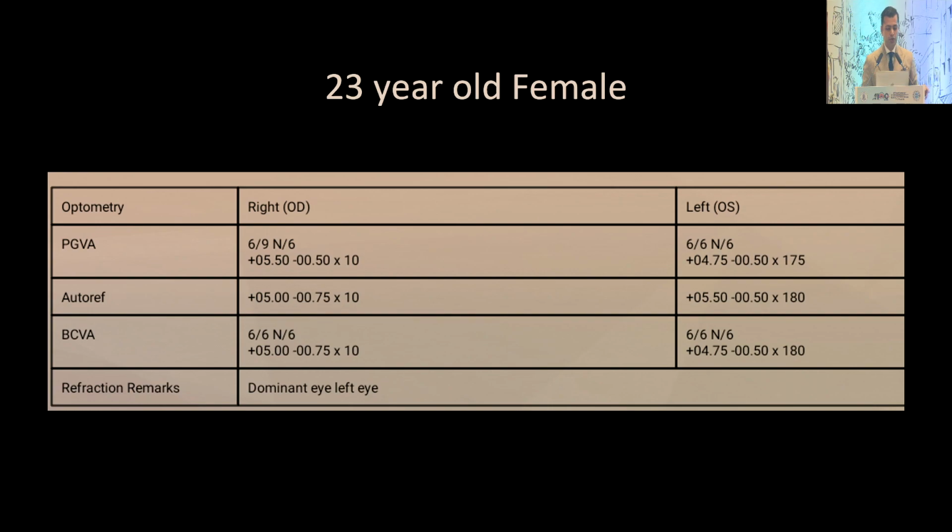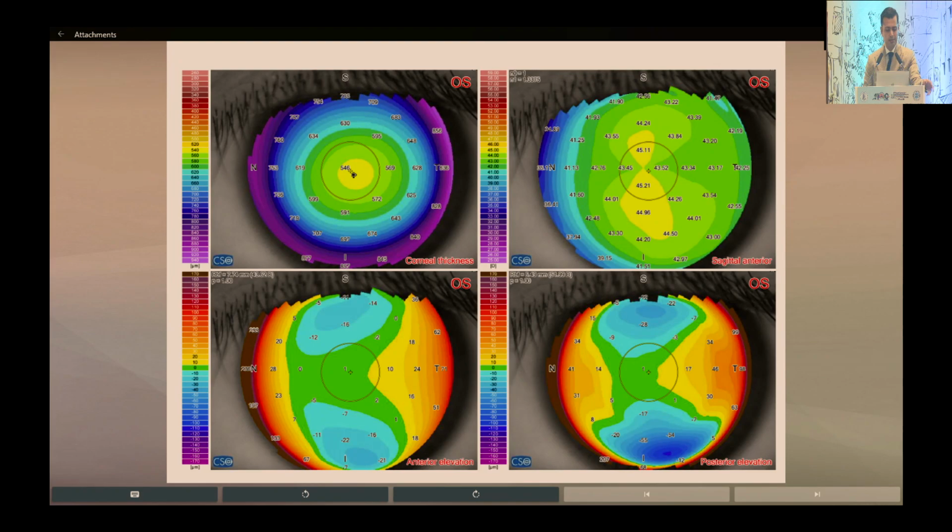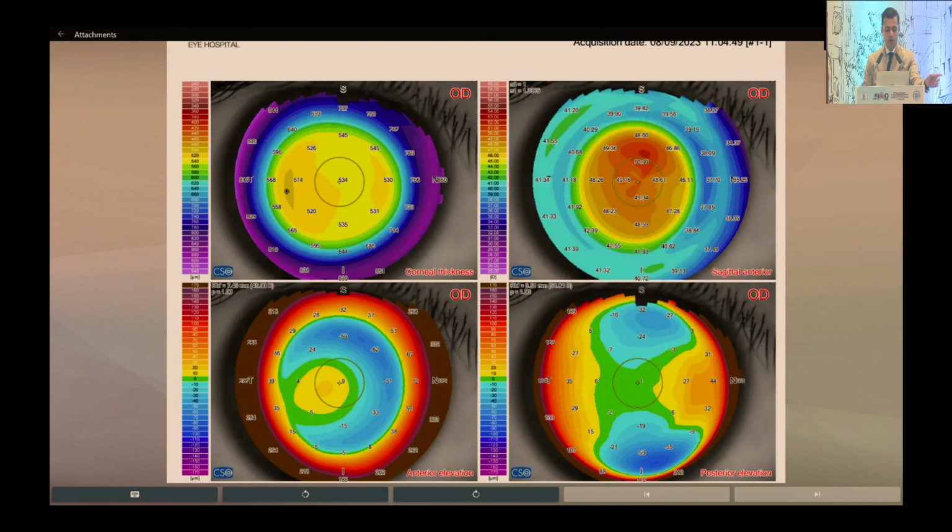Now this is just to show you a hypermetropic, and hypermetropes are a big situation. Whenever these patients turn up in our clinic, the amount of chair time that they take and the amount of investigation they take are huge. So this is the refraction. This is a close cycloplegic refraction, high hyperope. Everything else looks stable. There's a little bit of astigmatism. Again, everything unremarkable. But notice, so I did a Contoura on this patient and noticed post-operatively, if you can see a bump over here.